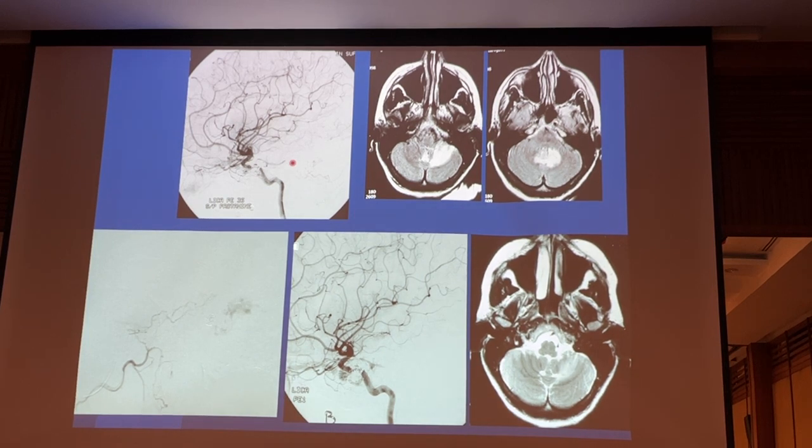The only arterial supply remaining was this one, the contralateral distal external carotid artery. You can see a small branch crossing over to the opposite side, filling the cavernous sinus and filling this draining vein.